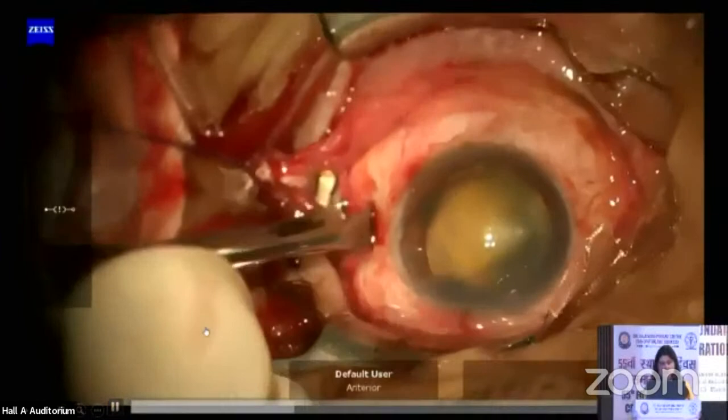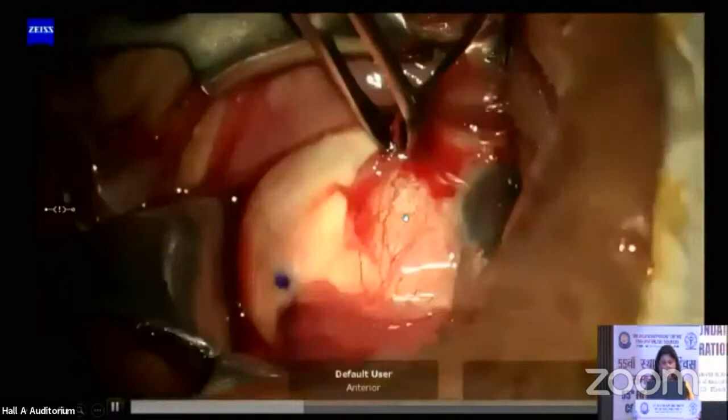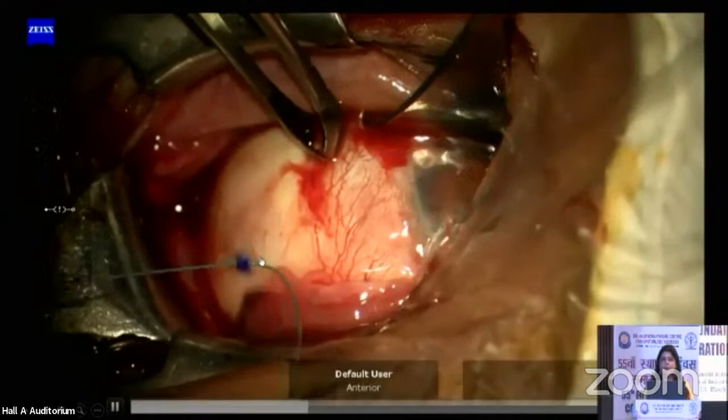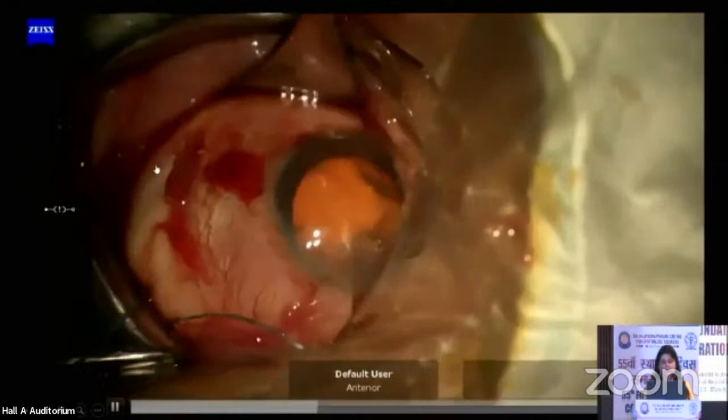This is the dummy plaque in position. It has gone right behind where we wanted it to. And here are the two eyelets. So we need to mark those two places where we are actually going to suture the main plaque onto the sclera. There are two eyelets over here, one superior, one inferior. So a marking has been done superiorly, and then another mark has been put inferiorly.